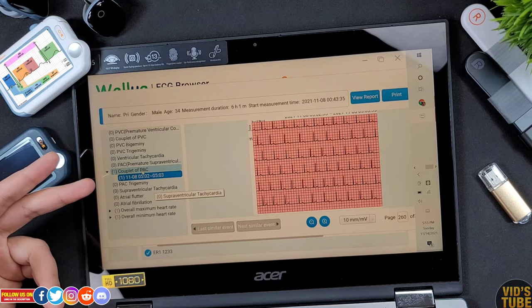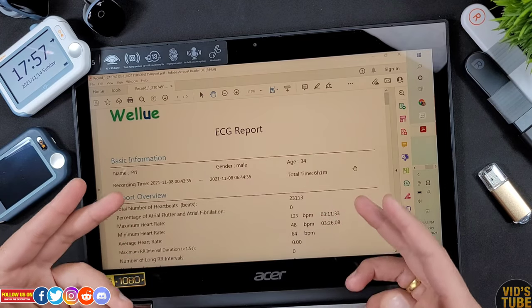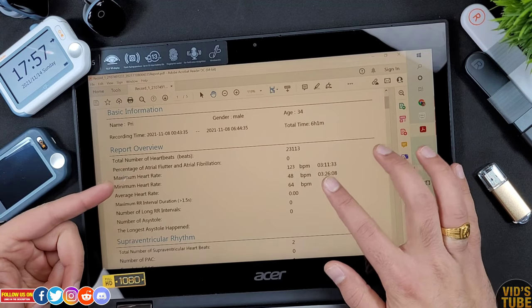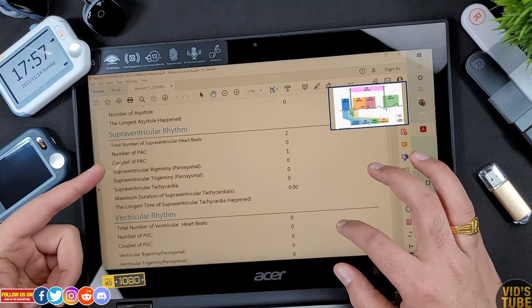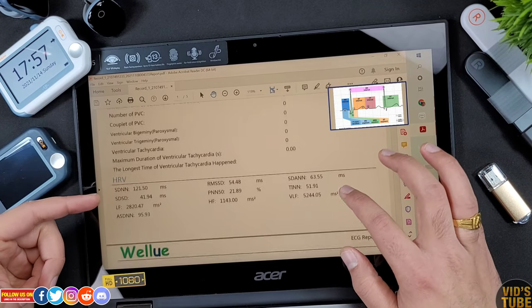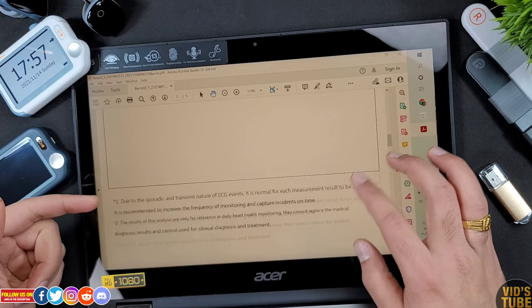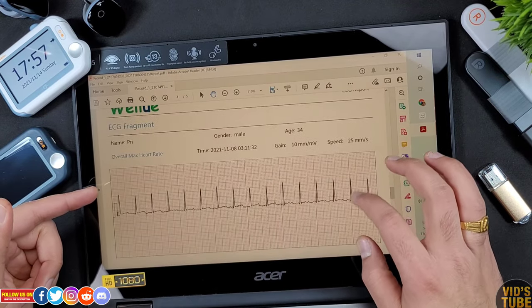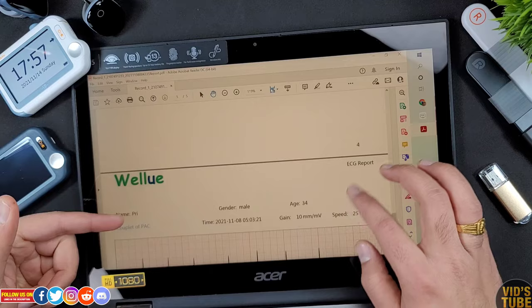When you click View ECG Report, it opens a PDF file without the graph, containing all required details like the maximum, minimum, and average heart rate. The report is well organized with a supraventricular rhythm section covering premature atrial complexes, ventricular rhythm covering premature ventricular complexes, along with BTEC and HRV — heart rate variability. The next page is the conclusion, followed by hourly statistical ECG data and individual recordings of abnormalities such as when maximum and minimum heart rates were recorded and the couplet of PAC.